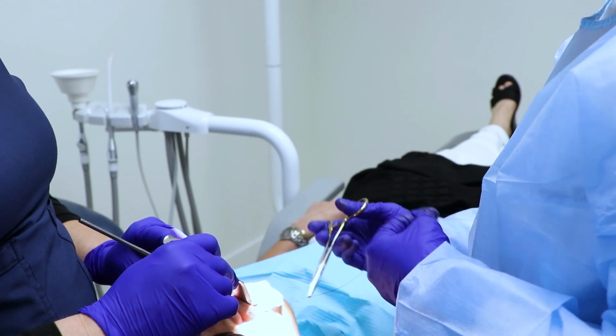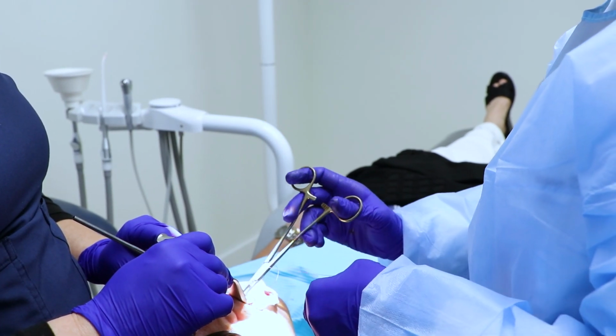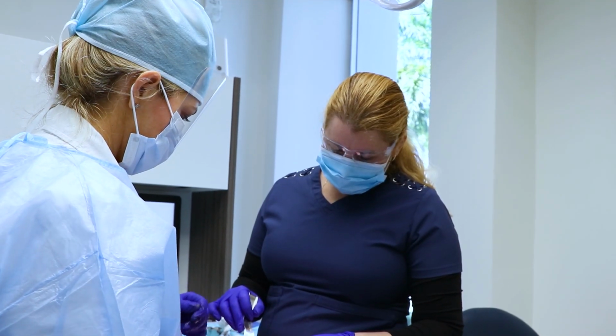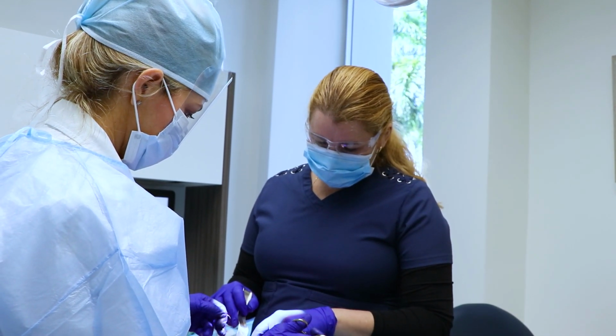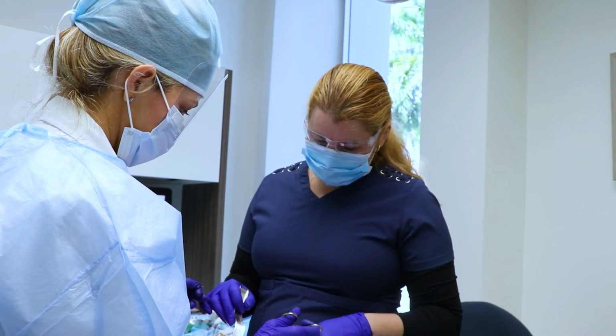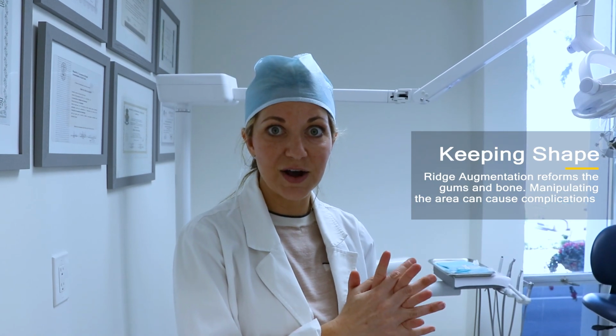It's really important to check the patient's partial denture to make sure that it's not pushing on that area of their face, because it will flatten the bone graft material. It's also important to tell the patients not to rub or massage the area, because you want to keep that bulk in place. You don't want to flatten it out.